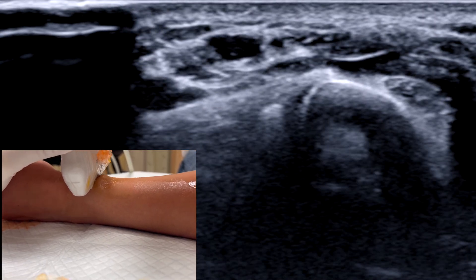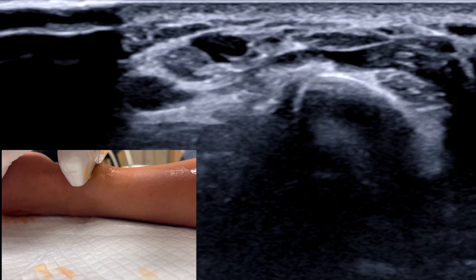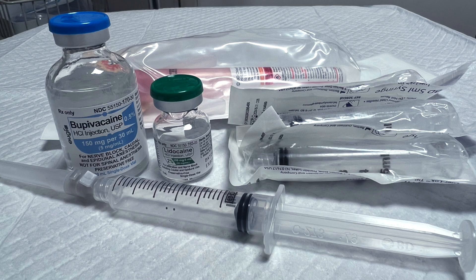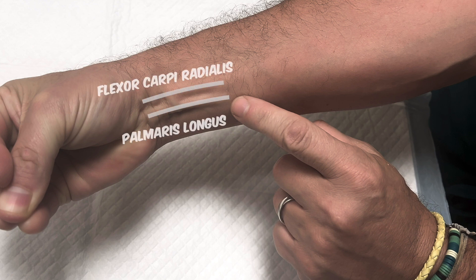Now that we've appreciated the sonoanatomy, we can understand the rationale for the landmark based approach. For this, you'll need some skin prep, four five-mil syringes of local anesthetic, and a one inch 25 or 27 gauge needle. Ask the patient to oppose their thumb and fifth finger and flex the wrist under resistance. This makes the tendons of the palmaris longus and flexor carpi radialis more prominent.